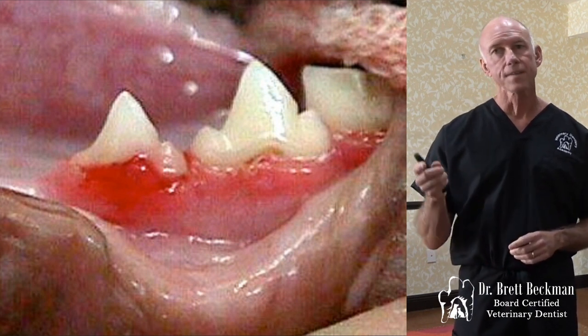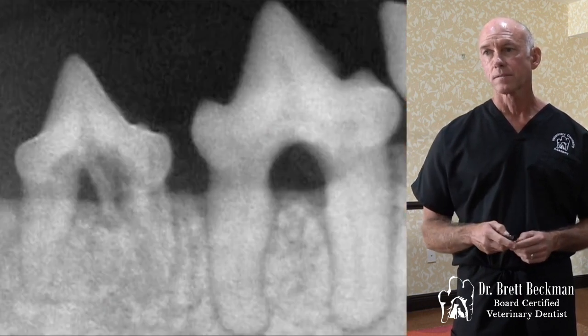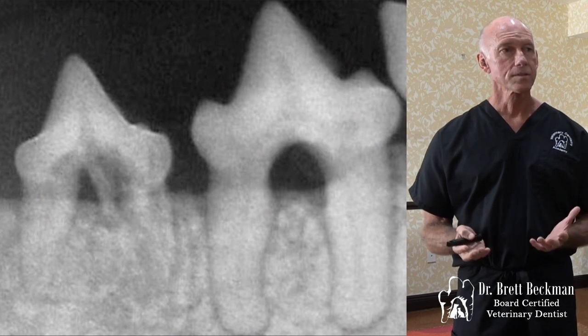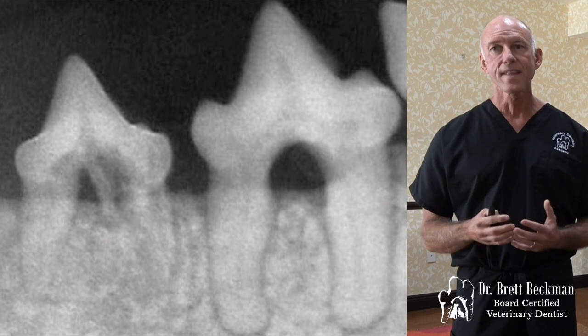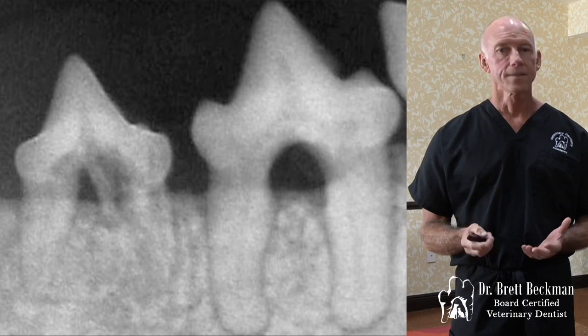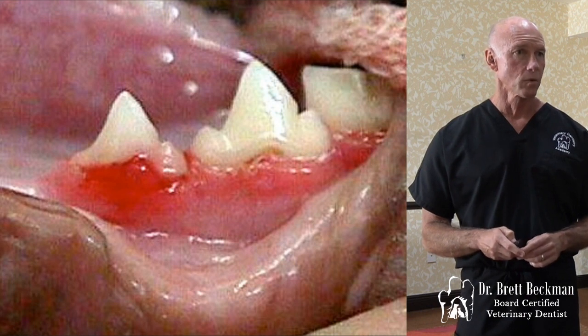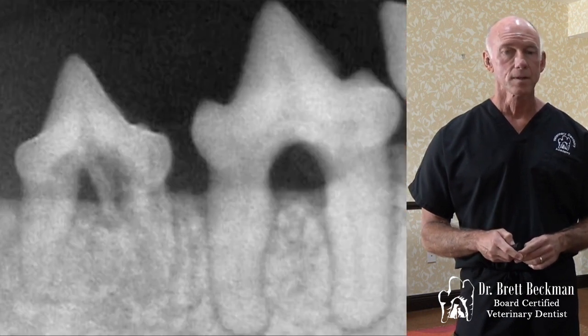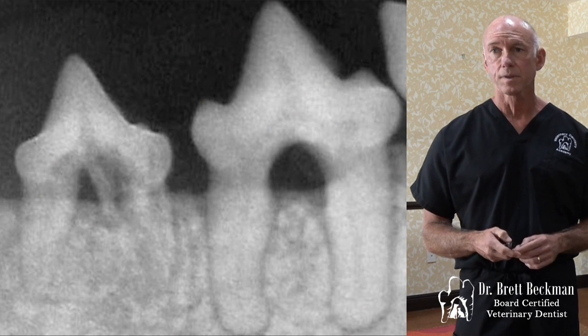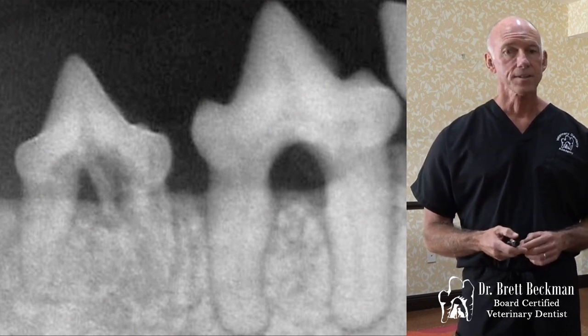The reason why you've got that zone is that you've got bone loss, got a big hole there on that tooth. So what's in that hole? Granulation tissue. So that's all inflamed, and that's why you've got that rim of inflammation that is equivalent to where that granulation tissue is, where the margin of the bone starts with the horizontal bone loss. So that is an extraction.